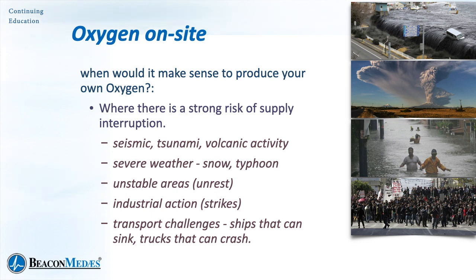So when would it make sense to produce your own oxygen? Well, obviously the first case is where you're likely to have a supply interruption: seismic activity, tsunamis, volcanic activity, severe weather, storms, snow storms, typhoons, hurricanes.